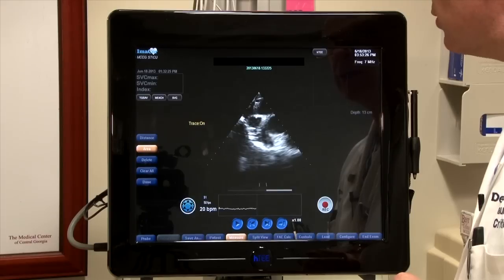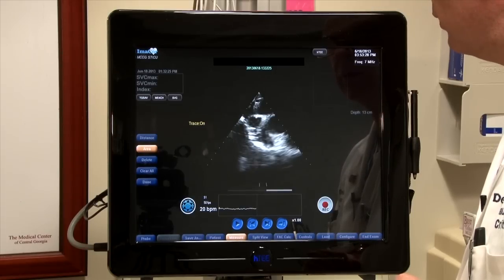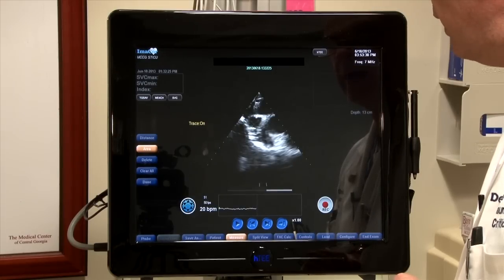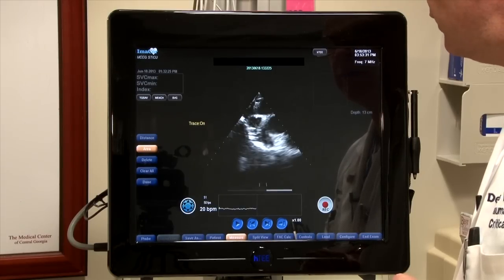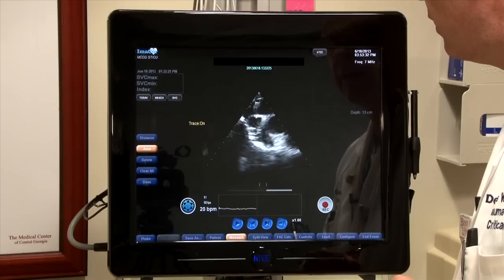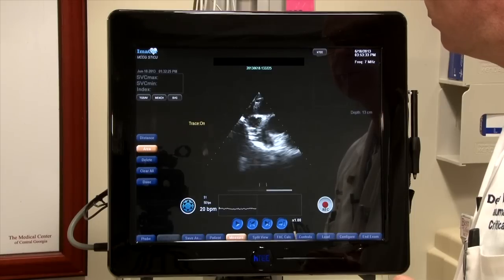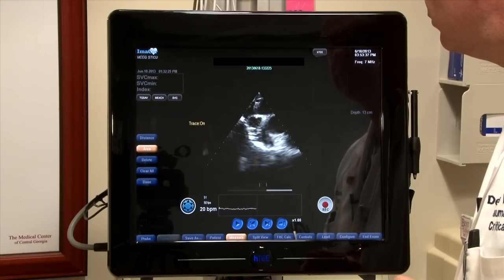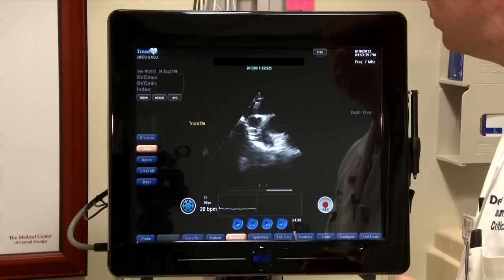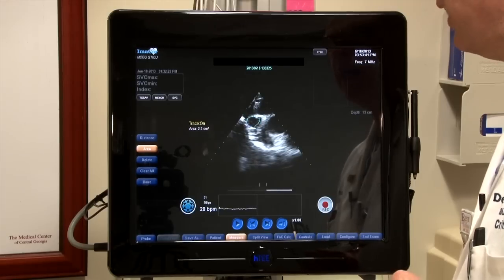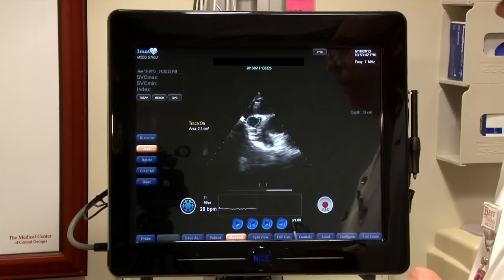And again, just like we've done before, I'll outline the edge of the SVC and get my area.